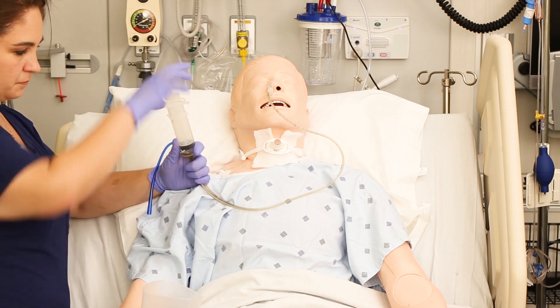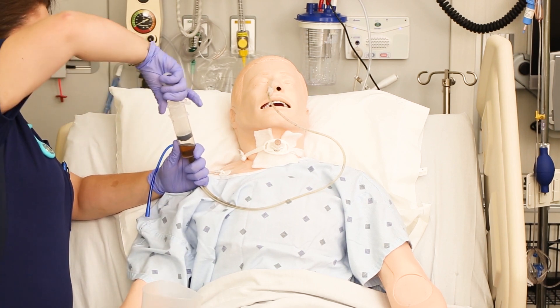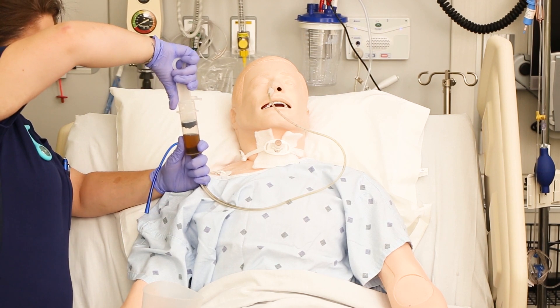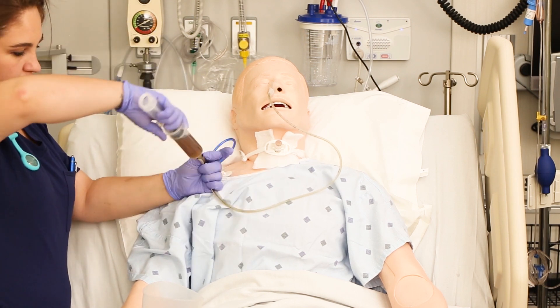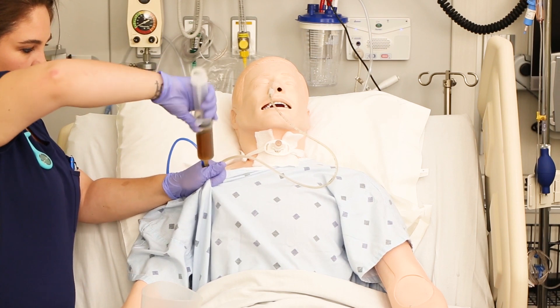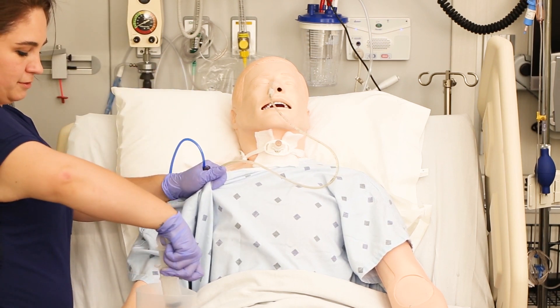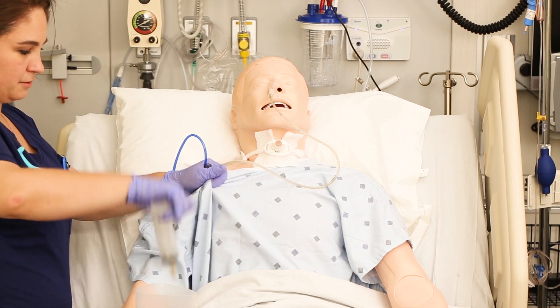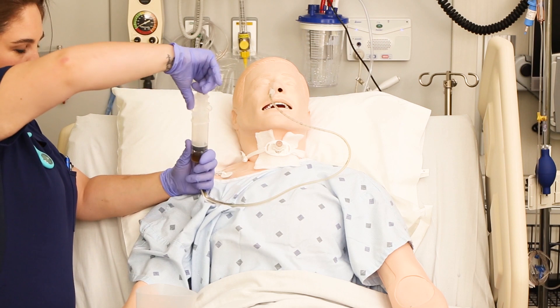Another thing we may do for a patient with an NG tube is measure gastric residual volumes — that's what's left over in the stomach. Use your 60 mil syringe to aspirate the stomach contents and collect them in a graduated cylinder so you can see the total volume, doing it one syringe at a time until the stomach is empty. When you're done, make sure you clamp the NG tube. Some NG tubes have a Lopez valve with a stopcock, others have a physical clamp.